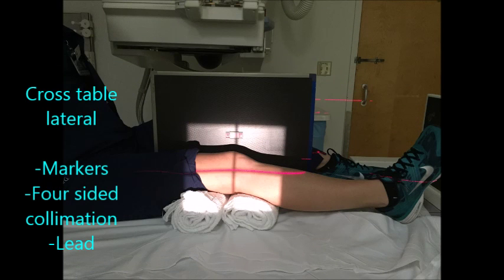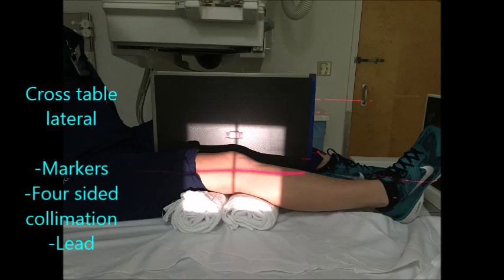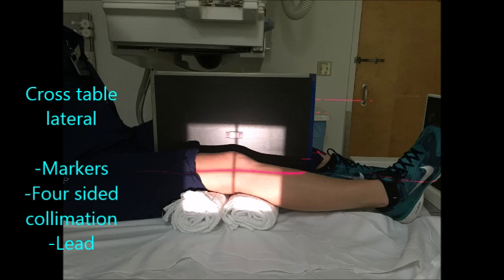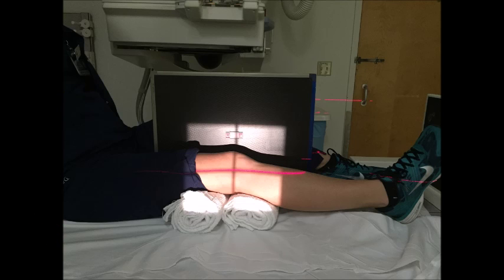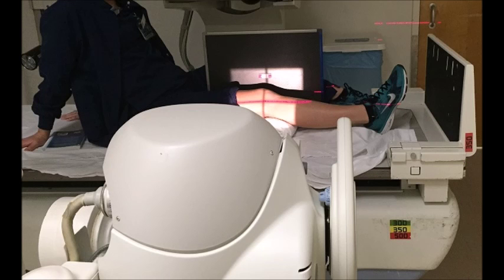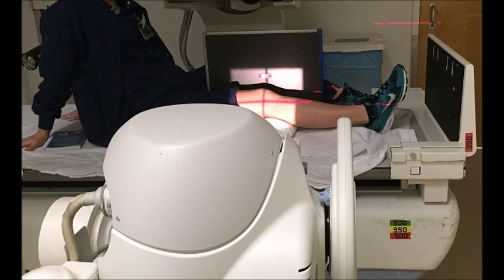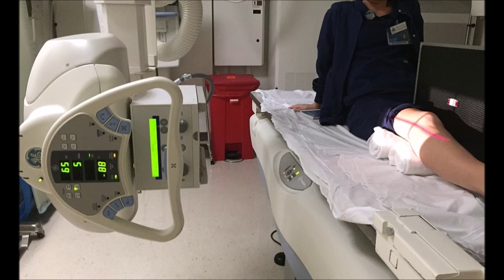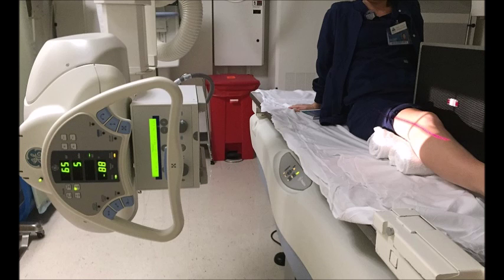Sometimes a cross-table lateral is used as an alternative in the exam due to patient condition. Be sure to adjust the tube and cassette accordingly and elevate the patient's knee.